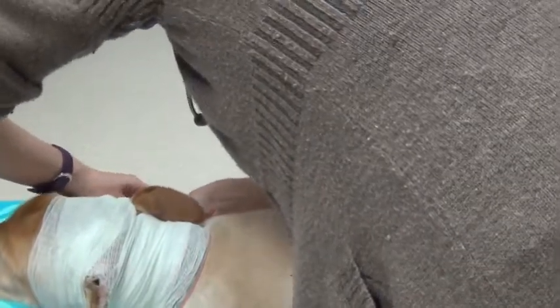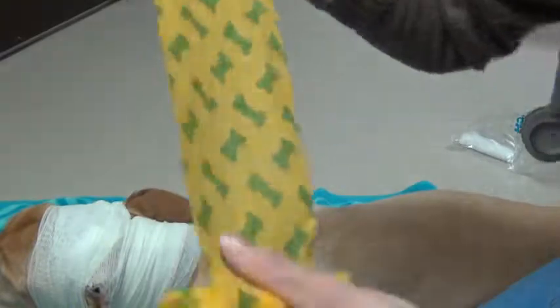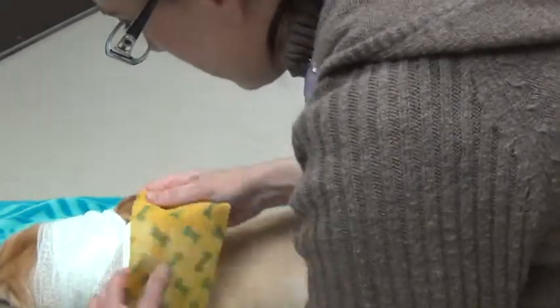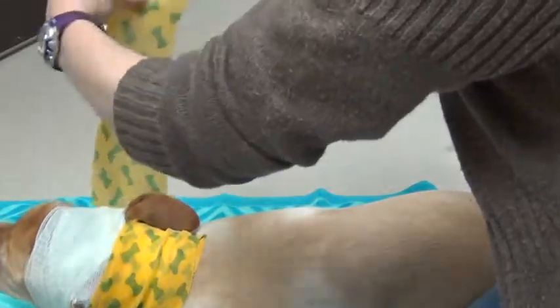And the next layer of the hematoma bandage is the vet wrap. So we're going to go ahead and vet wrap her using the big vet wrap. Okay. It's already been unrolled and loosened. We're just going to be gentle and make sure we don't wrap it too tight. Don't give it too much tension, because you can cause them to not be able to breathe if you wrap these too tightly around their neck.